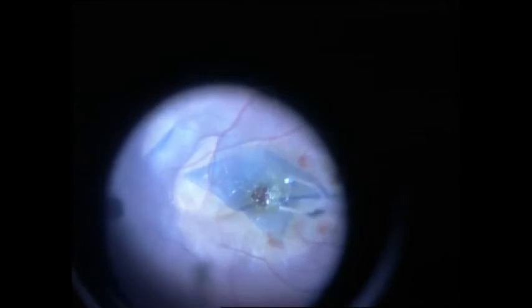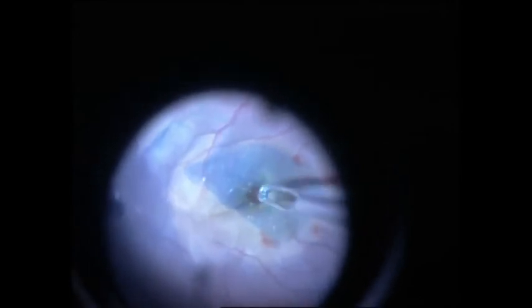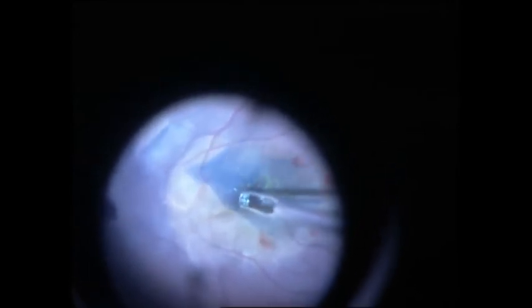Multiple ILM flaps inverted over each other using a small drop of viscoelastic over the macular hole.